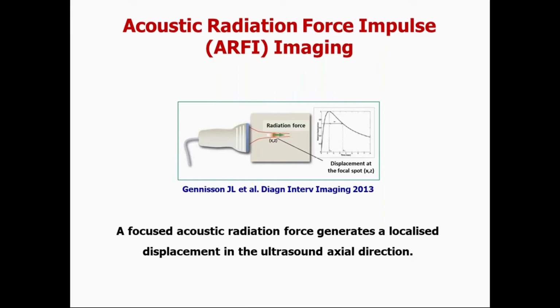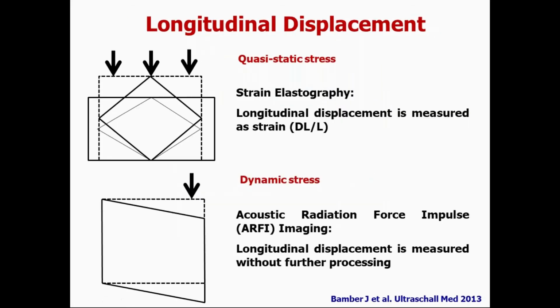It is also possible to use the force of the ultrasound beam, as in acoustic radiation force impulse imaging. In this case, a focused ultrasound beam is used to generate a localized displacement in the ultrasound axial direction.